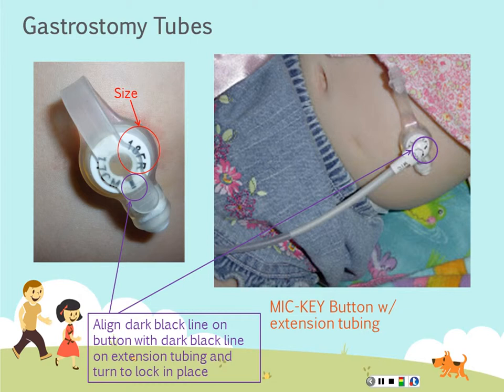When we're assessing these tubes as well, because they are surgically placed, you can draw back and check the residual on them, but you're more looking and assessing these sites for whether they're in place and whether there's any complications with those.